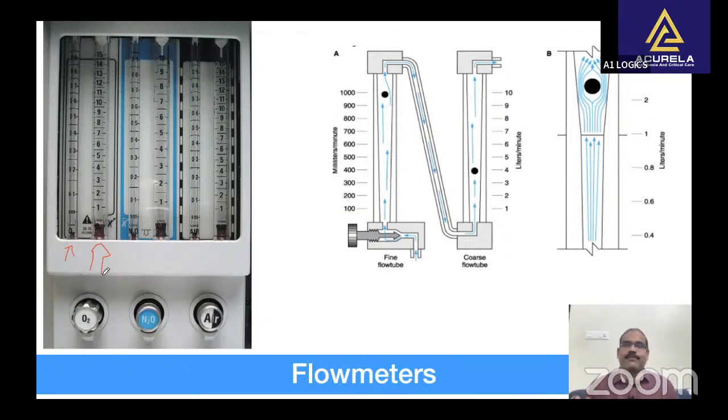These cascade flow meter tubes for each gas are arranged sequentially so that when the flow control valve is opened, the low flow tube is seen to register first. At flows over 1 liter per minute, the bobbin in the low flow tube is no longer easily visible.